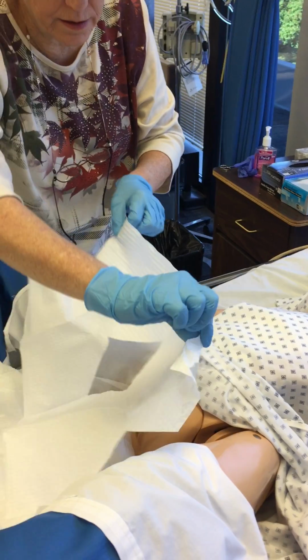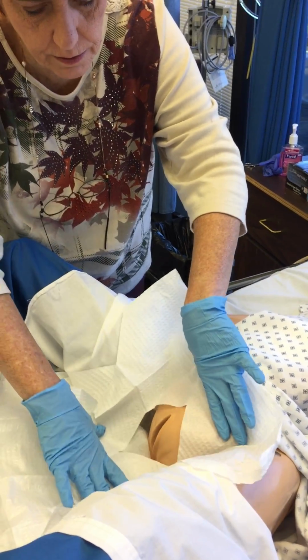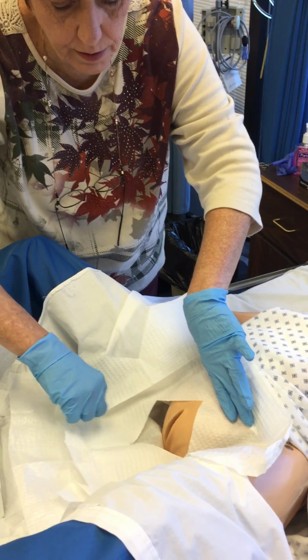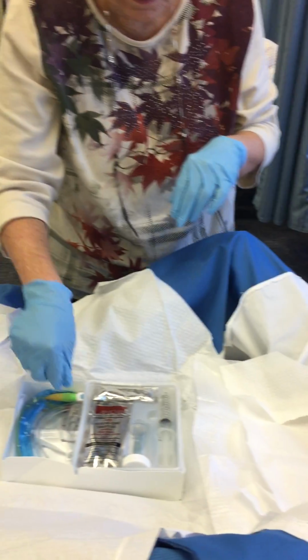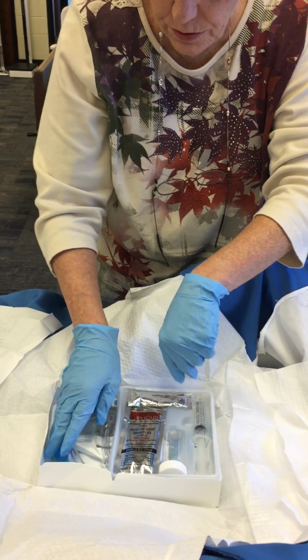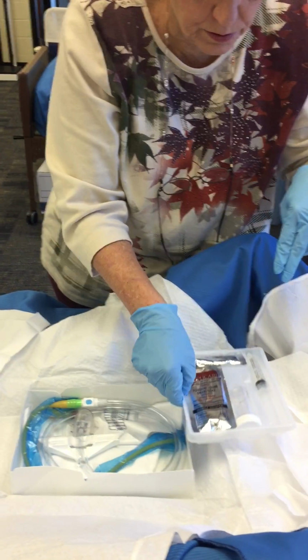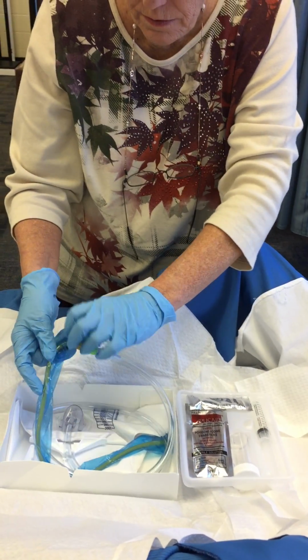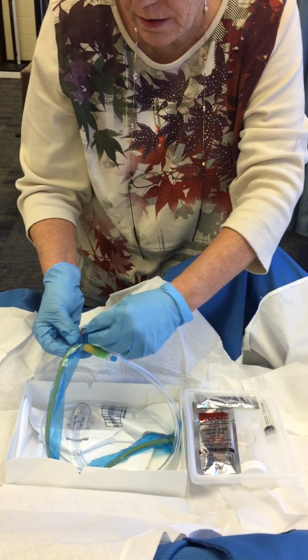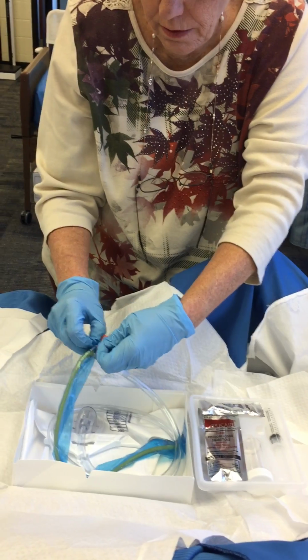What this does is gives you a sterile field. Okay, this is sterile, so you know everything in this whole area is going to be sterile. So you can slide this back even if you need to. Slide this forward if you need to. While you've got two hands, go ahead and open your catheter.